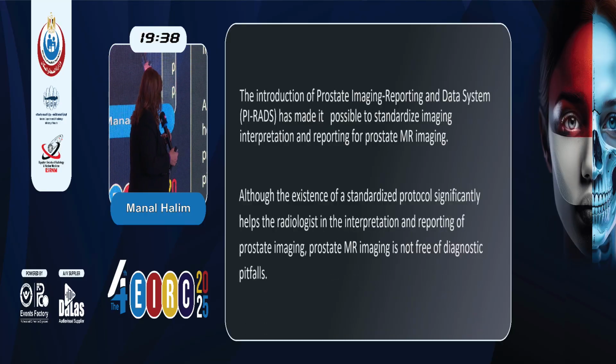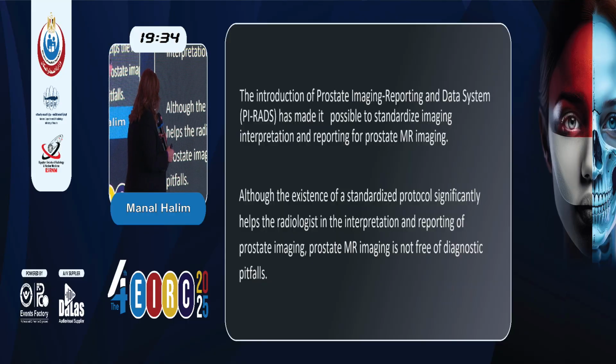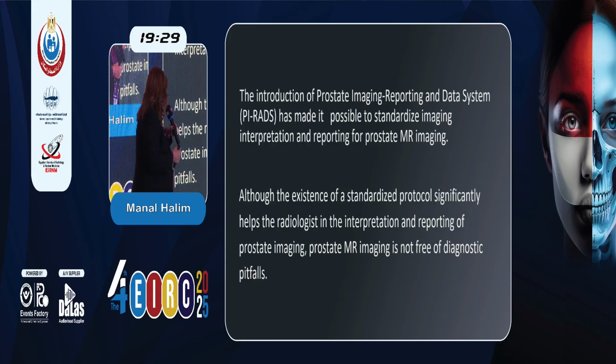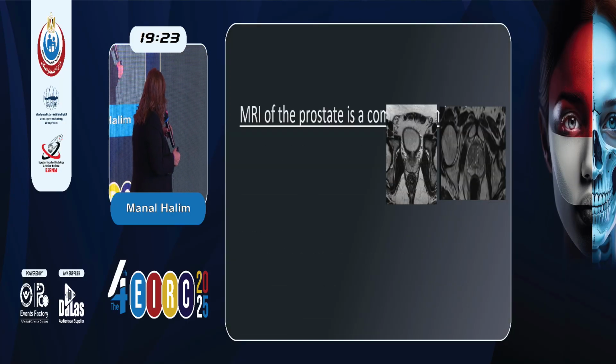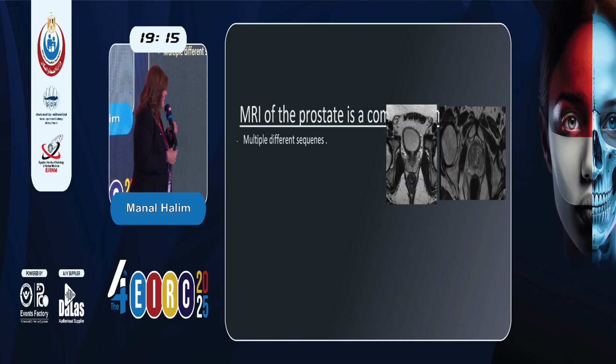Although the existence of a standard protocol significantly helps the radiologist in interpretation and reporting, prostate MRI imaging is not free of diagnostic pitfalls. And why is it not free from diagnostic pitfalls? Because MRI of the prostate, as Professor Rouge said, is a complex examination, has multiple different sequences, and each sequence has its own artifacts.